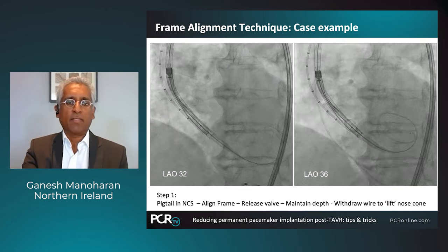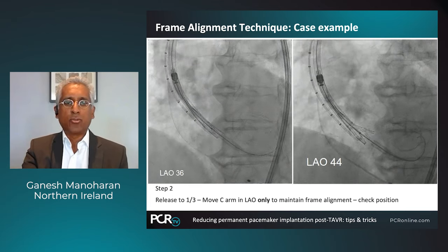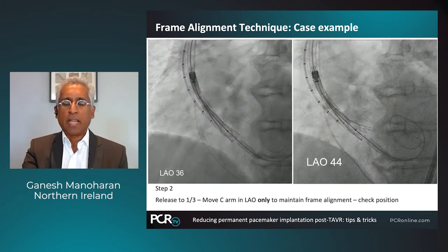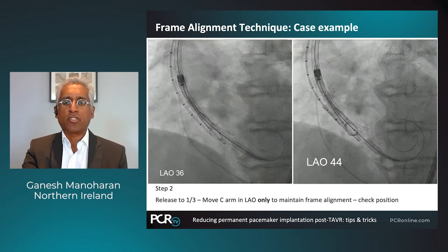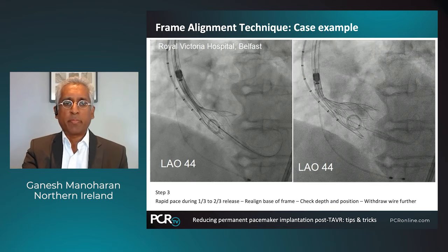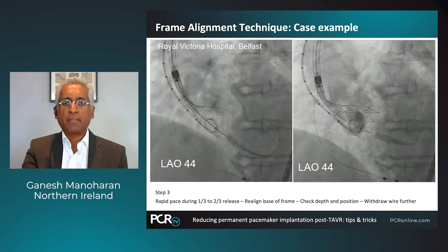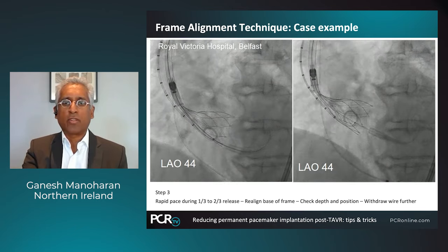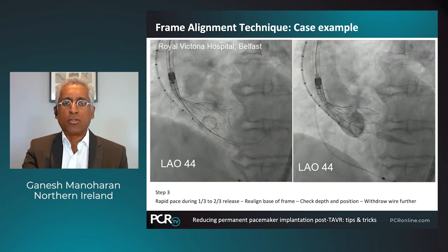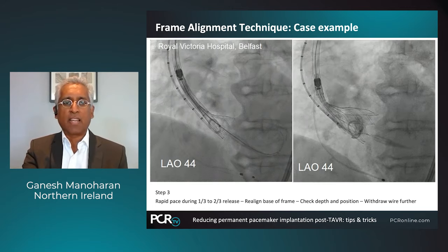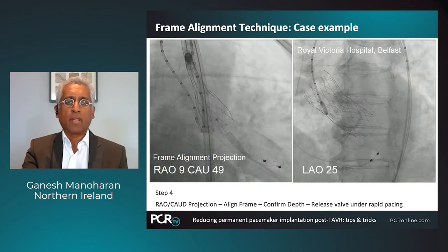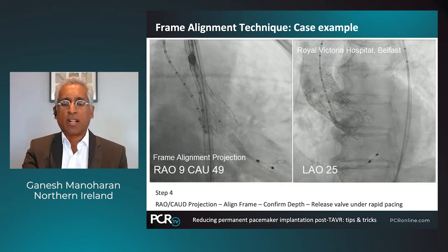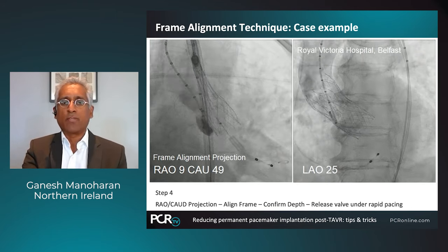You keep releasing the valve, going to RAO 36 to align the frame. At one-third release, you're at RAO 44. Depth is maintained at about two to three millimeters. Take an angiogram and check position. Then go from one-third to two-thirds with rapid pacing, realign the frame, and check position. Depth looks good at two-thirds — about three to four millimeters in both the non-coronary and left coronary. The important part: go to an RAO caudal angulation, align the frame — RAO 9 caudal 49 — take an angiogram, confirm depth, then go back to the previous RAO angulation and release the valve under rapid pacing again, realigning the frame this time to RAO 25.